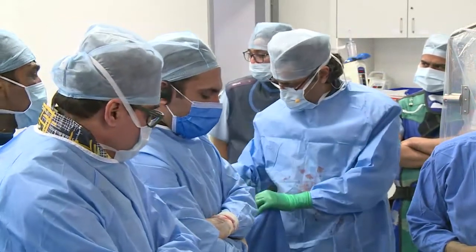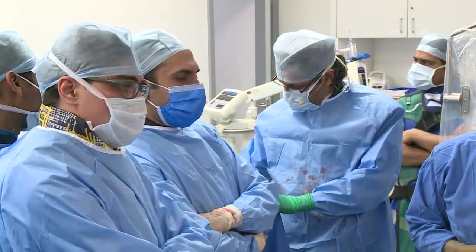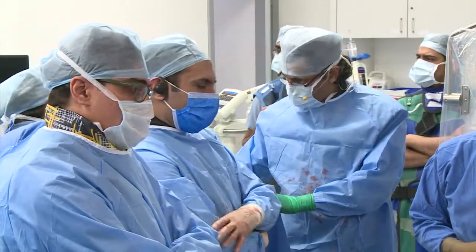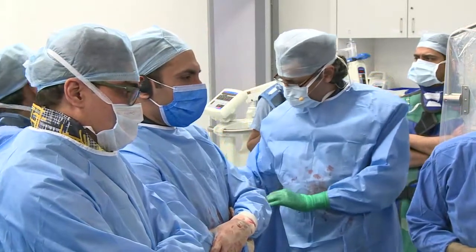We haven't seen it, but what we do is we try to test this during our balloon aortic pre-dilatation. We do a rapid test of the pacemaker. There are some centers who use a temporary screw-in lead. We don't use it.